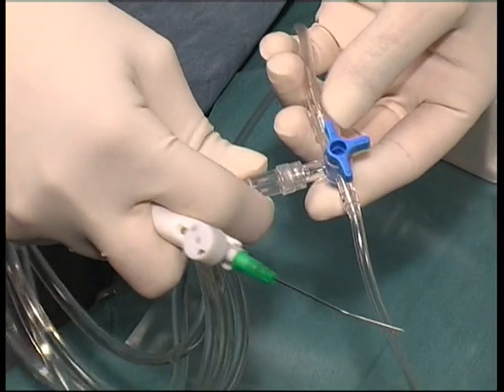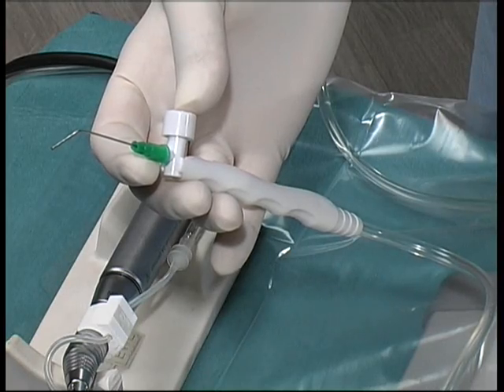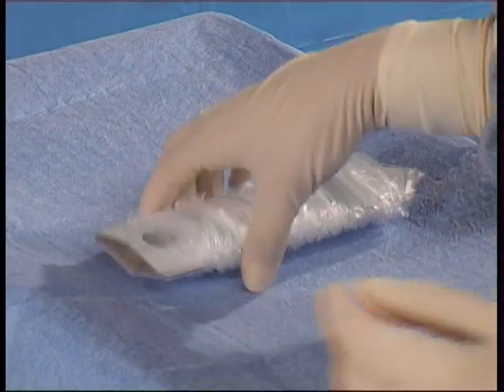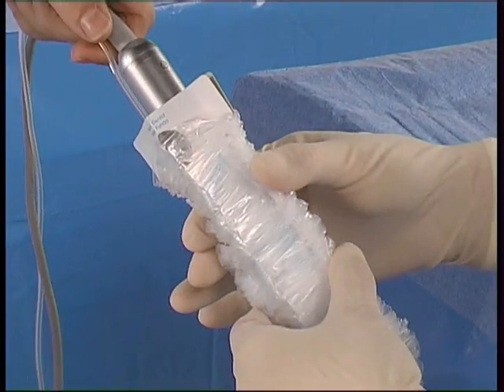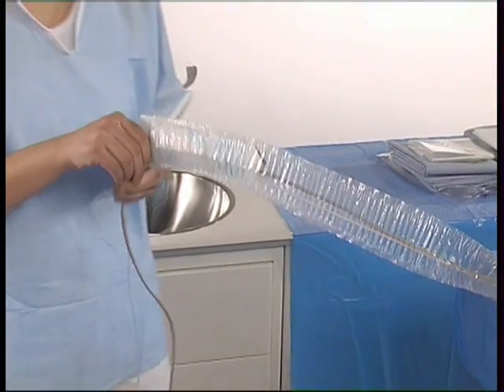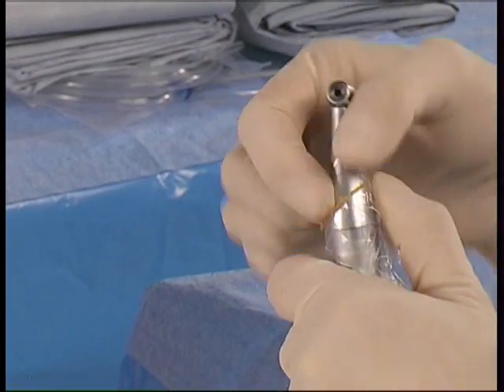Additional cooling systems, such as the Omnia irrigator, can integrate the traditional systems, provided these are equipped with suitable couplings. The Omnisleeve inserter makes it easier to fix the sheath onto the cables and suction pipes. She fixes the sheath to the micromotor with the elastic band.